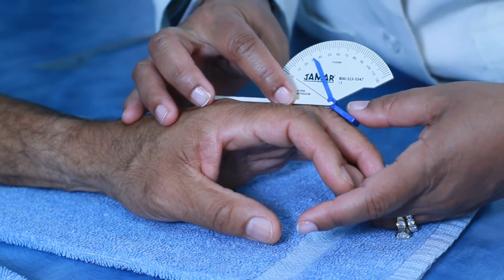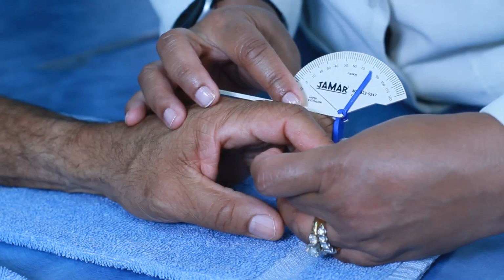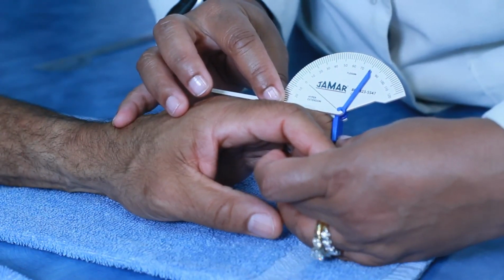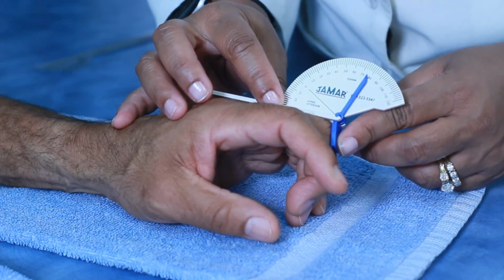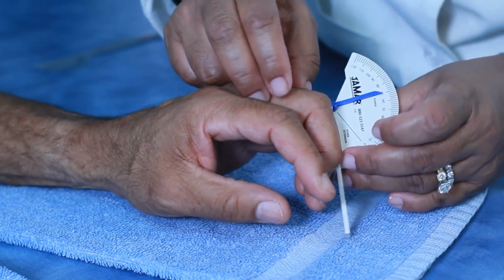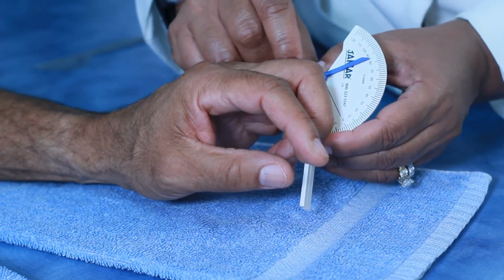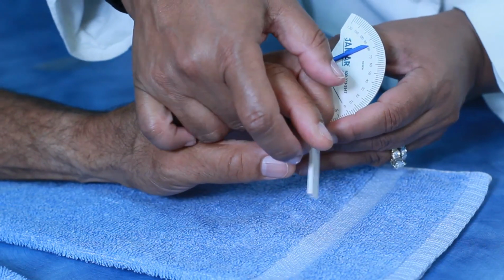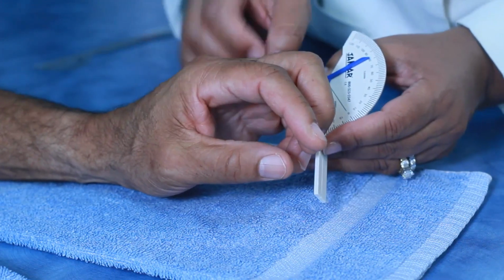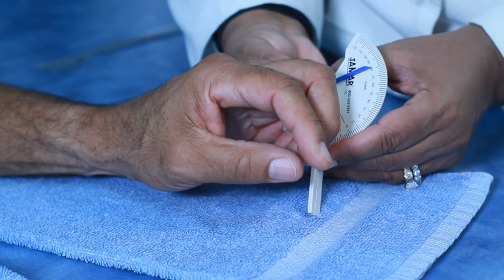Then we're going to move over to the ring finger, and here he has 80 degrees. There's your 80. Again, the proximal end of the goniometer is on the P1 and the distal end is on the P2, the middle phalanx. I'm going to turn it this time only because he has on the wedding band, so that I'm not affected by the goniometer lifting up. On this measurement, without my help, he has 80 degrees. And on the small finger, he also has 80 degrees.